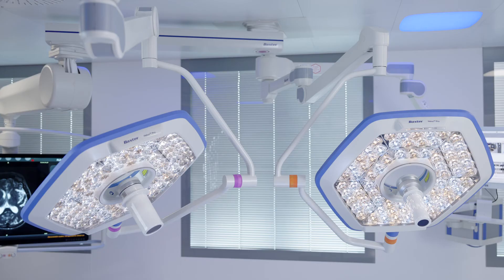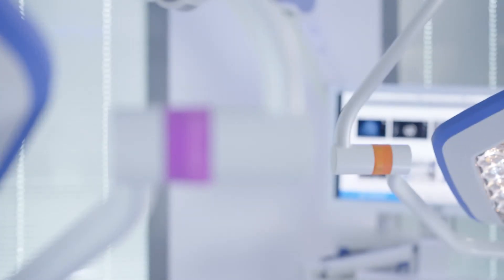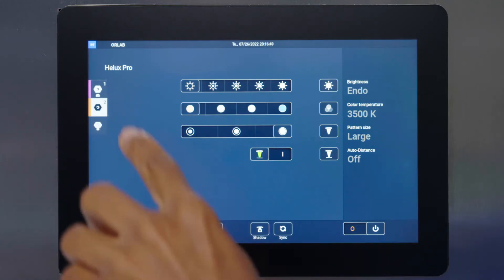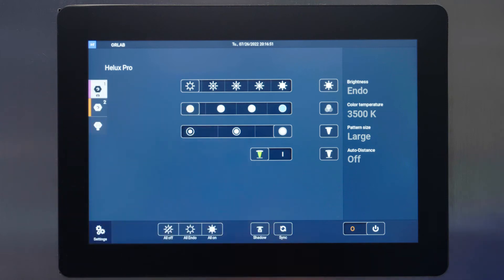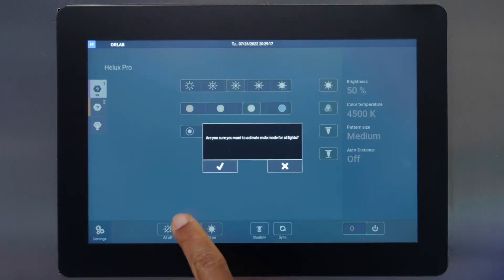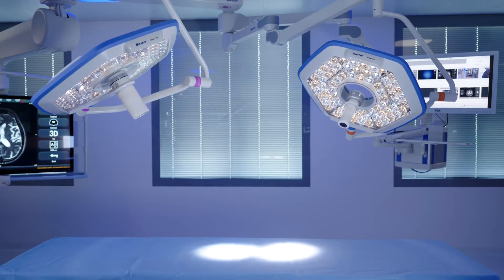To differentiate the lights if there are multiple lights in one OR, refer to the color coded bands on the light arms that correspond with the color codes of the light heads on the wall control panel. Endo mode is also available when a darkened room is needed during endoscopy cases. This can only be turned on and off at the wall control.